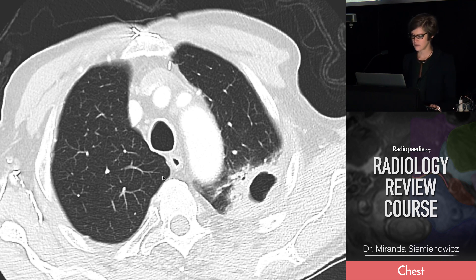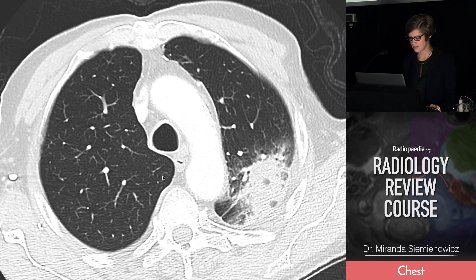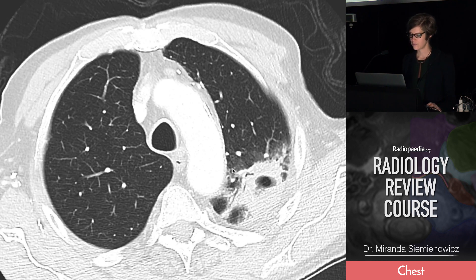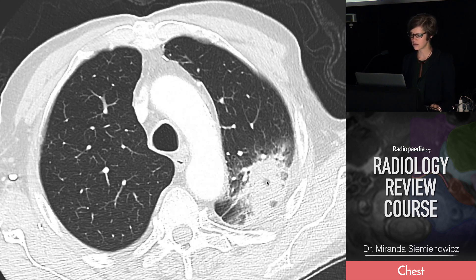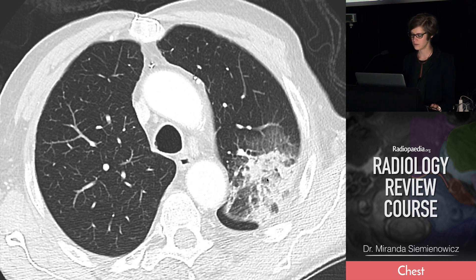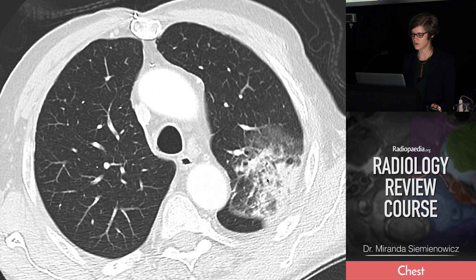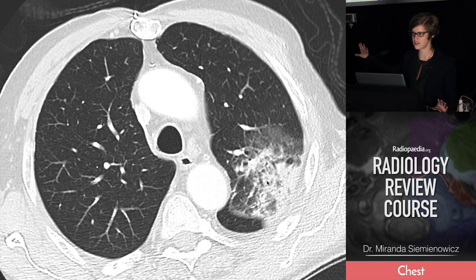When you come down out of the cavity and look at that peripheral opacity, it's completely confluent with this opacity more inferiorly, that fades out into this ground glass periphery. If I just showed you that slice, I don't think anybody would have any trouble calling this pneumonia — which is what it is: cavitary pneumonia.